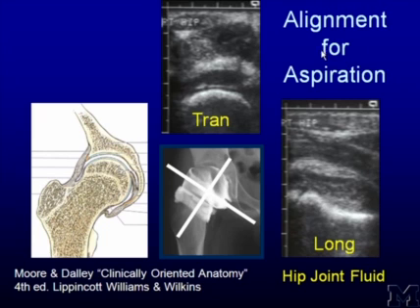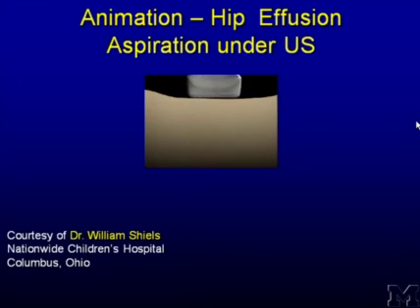And there are a few ways you could do it. Knowing that you want to go over the femoral neck, you can do your sonography, locate the effusion on longitudinal view, locate it in transverse view right there, and kind of X marks the spot. Then if you don't want to use imaging to actually put the needle in, just go straight in at that point, and you should be able to obtain fluid. If you're having trouble, then you could put a sterile cover on the transducer and take a look and see where you are. Some people actually like to do it under guidance.